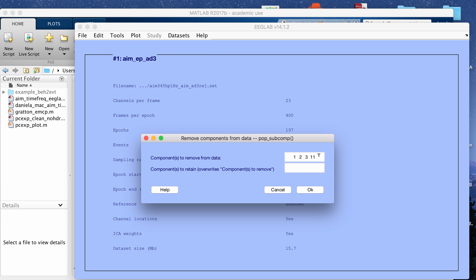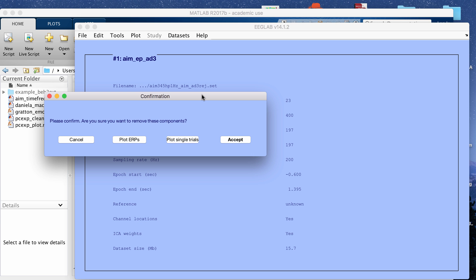The ones that I marked for rejection in that previous window are shown here. I'm going to click OK and have these components removed. Before EEGLAB does that, it's going to show you this little confirmation window so you can check what the data will look like before and after you remove the components.